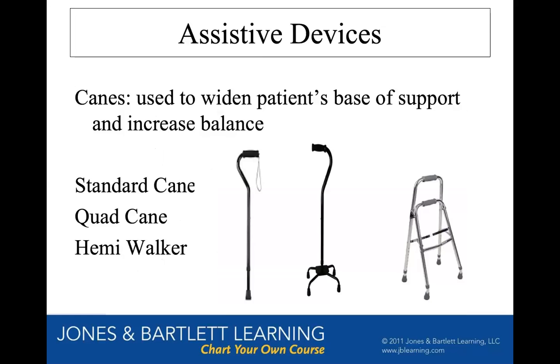It has four prongs. I think those are evil, and I don't like them, and I have a bias against them. And one day I will tell you why. For now, just know that Miss King and Mr. Allen hate quad canes, and we better not ever see you using one, or we will go off on you. Quad canes are not as bad as what's next on the screen, on the right side of the screen.